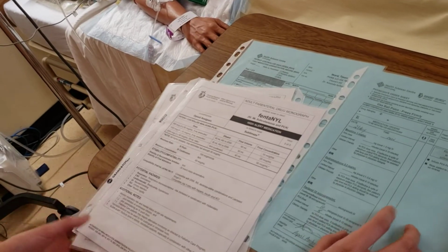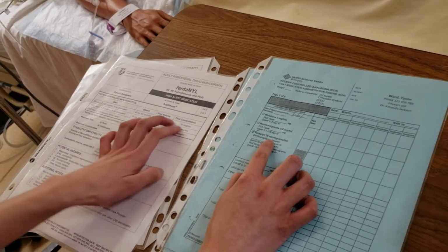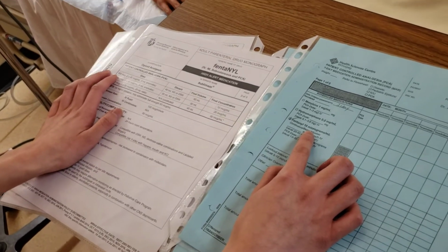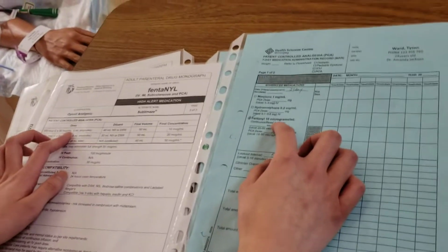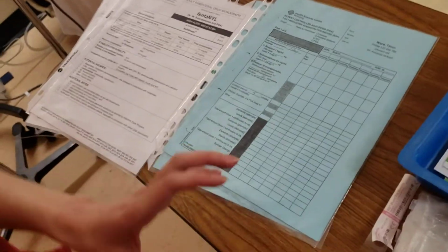For the doctor's order of fentanyl 10 micrograms, we would need this concentration recipe: 10 micrograms per ml. To get that I would need 500 mcg, or 2 of the 50 mcg per ml of the fentanyl. To get my supplies ready, I do hand hygiene and then gather my supplies.